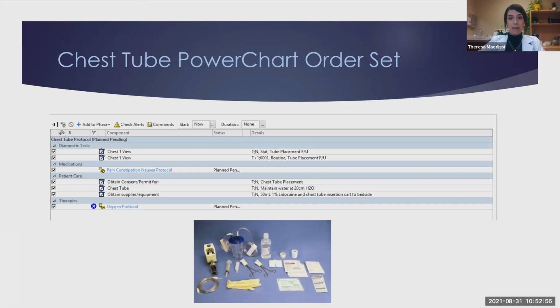When setting up for chest tube placement, you're going to need consent. Like always with any procedure, you have to explain the risks and the benefits to the patient prior to the procedure. This order set also includes the amount of suction. Like I said, -20 is pretty standard. It also includes all the supplies that are needed to get set up for the chest tube placement, and then oxygen protocol.